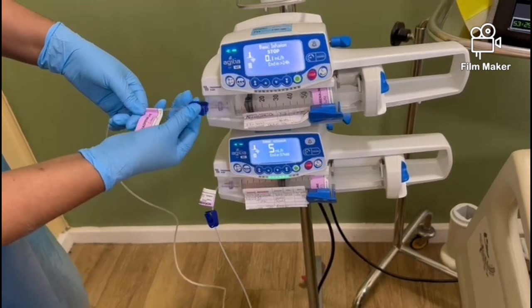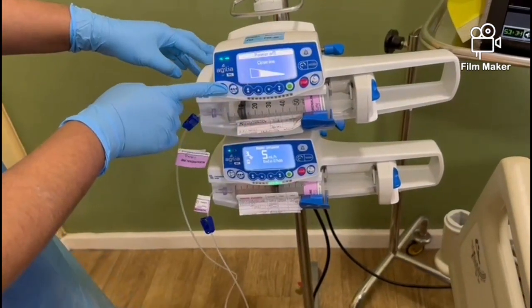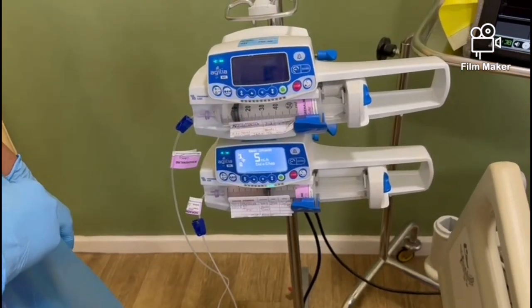Turn off your infusion and leave the syringe and the line connected to the octopus. The 10 ml left in this old syringe can be used as the backup pump.